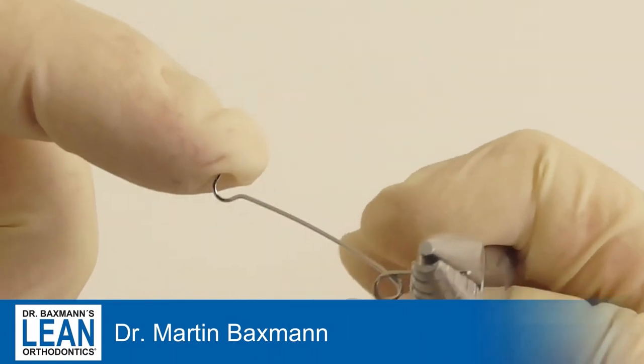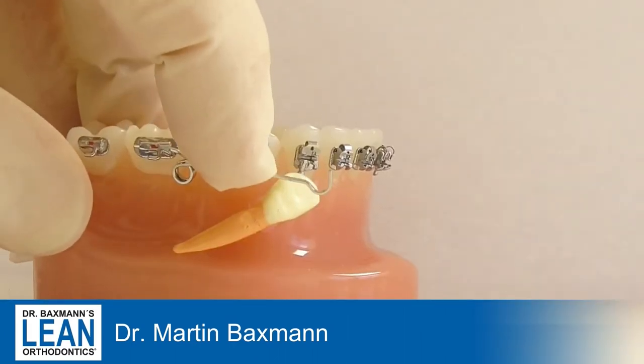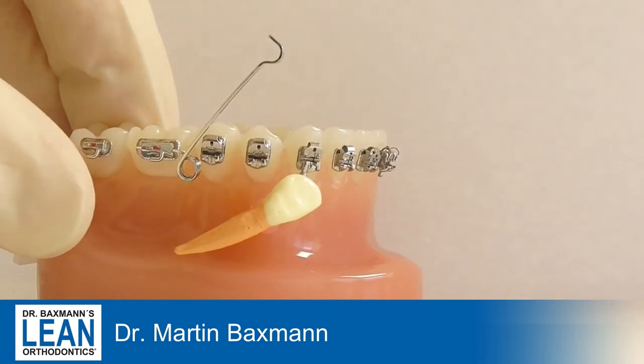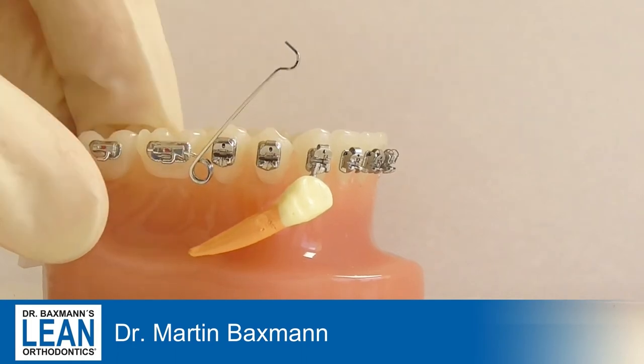We will have some activation that will be around 45 degrees, as you can see here. That's how it works — you put it in a molar tube and the long arm goes down to the canine to bring it up.